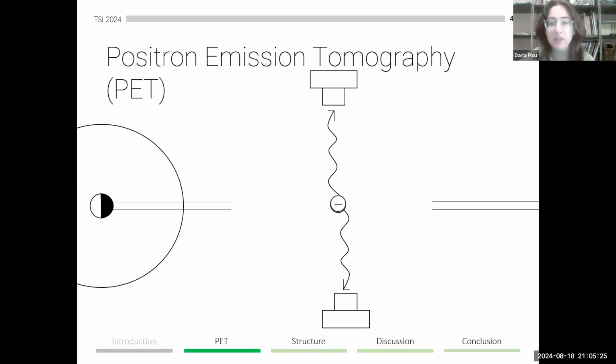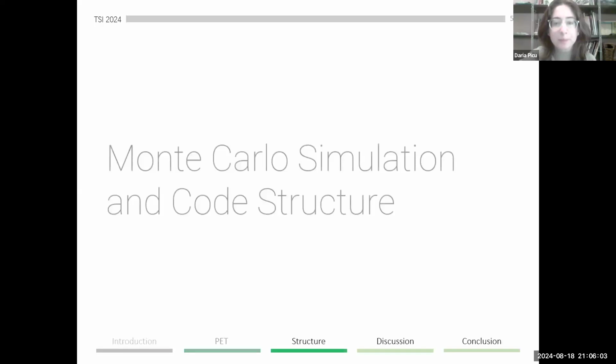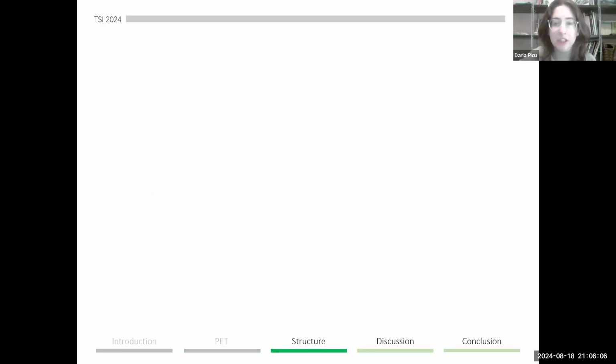The distribution of radioactivity within the patient's body is going to be reconstructed from the detection signals, and then adjustments are going to be made based on any calibration information. Coincidence detection is fundamental to PET image reconstruction. A coincidence is recorded when two detectors detect annihilation photons within a specific timing window, forming a coincidence line between these two detectors. The coincidence lines are then used to locate the emission source. In this report, we present the visualization calculated from Monte Carlo simulation from Massachusetts General Hospital, specifically the Sabbath lab. So going into how our simulation actually works.